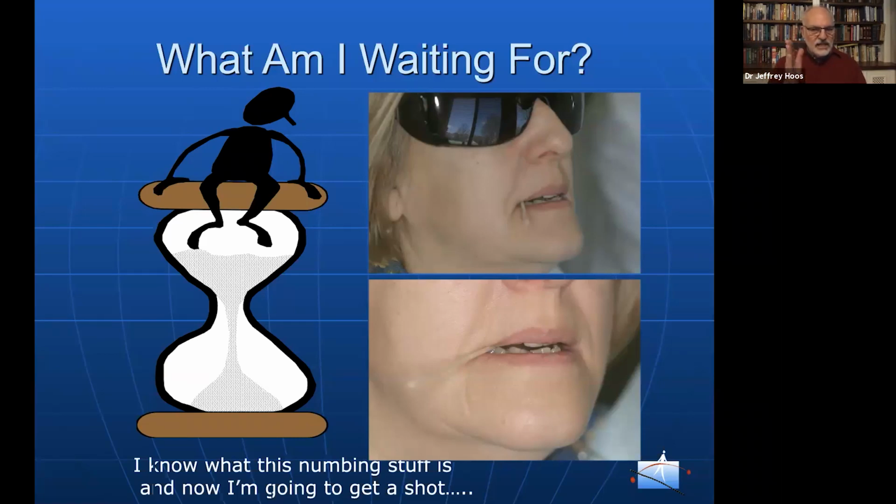So now, I shot this picture of this patient, and I have no idea why I shot this picture. And it's topical that's being applied for an inferior alveolar block on the left-hand side. And I came back into the operatory after waiting and doing a hygiene check, because quite frankly, applying topical is very cool. You apply some topical, you got some time, you can go do a hygiene check, and come back and give your anesthetic, right? It's good practice management.